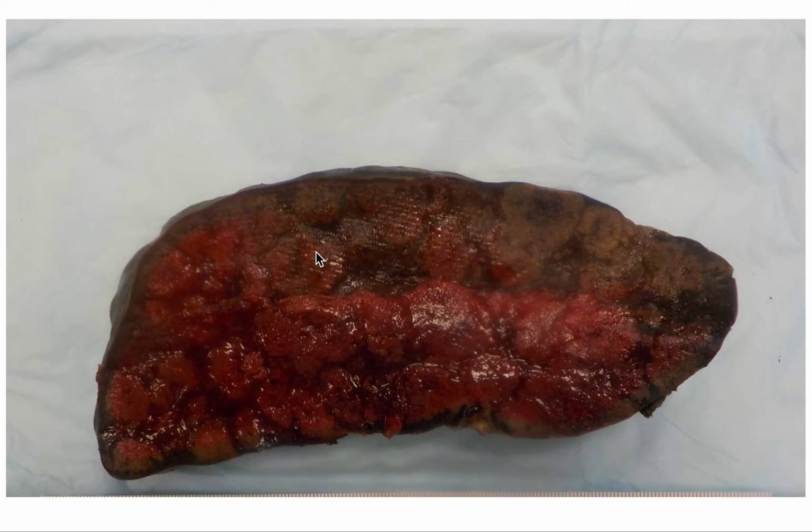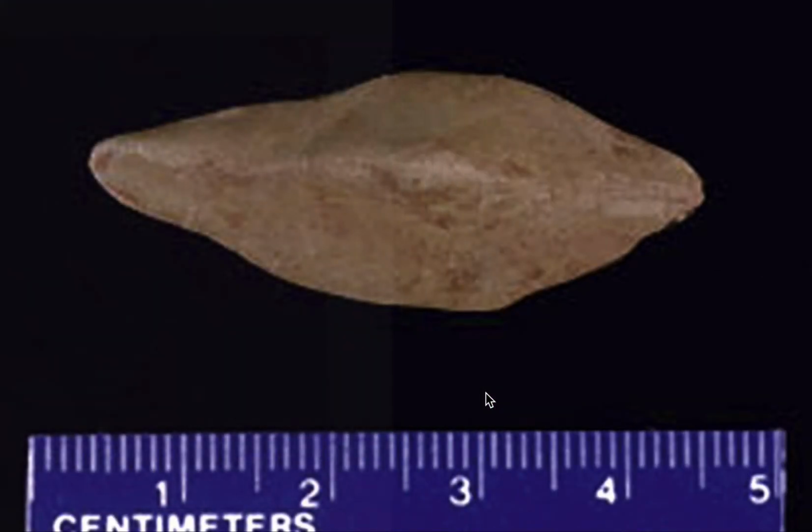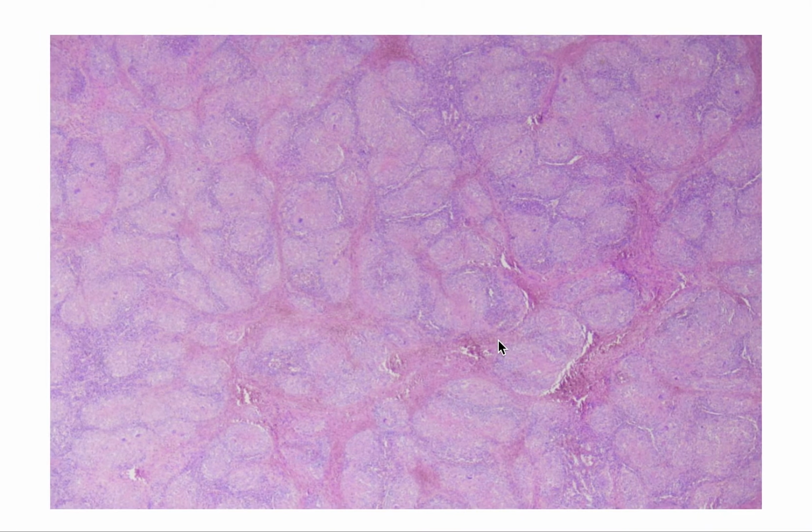It has this nodularity, ill-defined. Histology showed back-to-back granulomas, some with central necrosis, or necrotizing granulomas. This was AFB positive in an HIV patient.